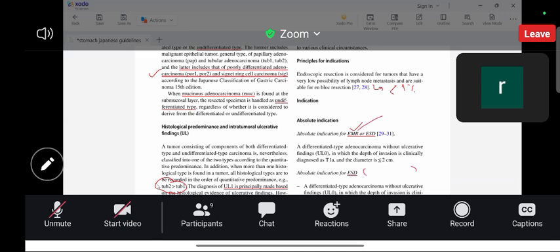As in EMR, we know that we are going to resect the mucosa only. So very limited tumors will be the absolute indications that we can understand by the explained criteria. It should be ulcerative 0, differentiated, and less than or equal to 2 centimeters, T1A. This will be the only indication for EMR.